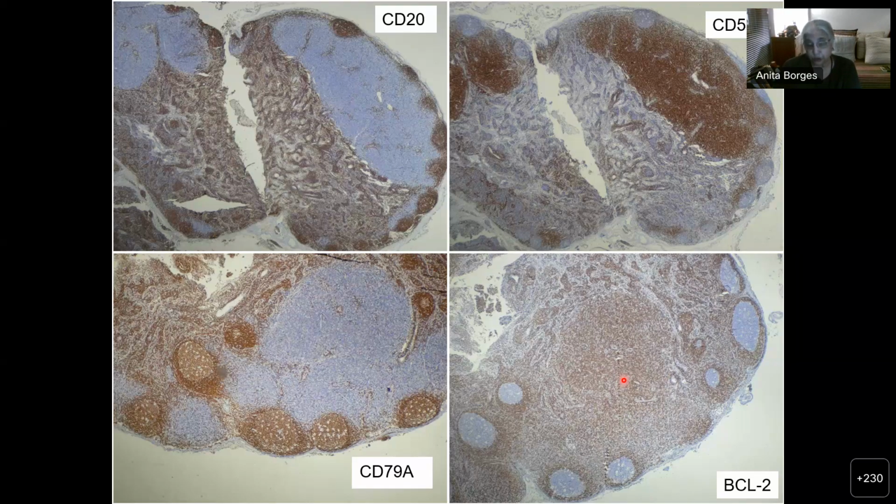But if you see CD10 being expressed and there is no BCL2, then that is very unlikely to be a follicular lymphoma. There are lots of exceptions to all the nevers and evers, but that's what biology is all about. But this is what a reactive follicle looks like, very nicely showing your idealized version of what is a cortex and what is a paracortex.